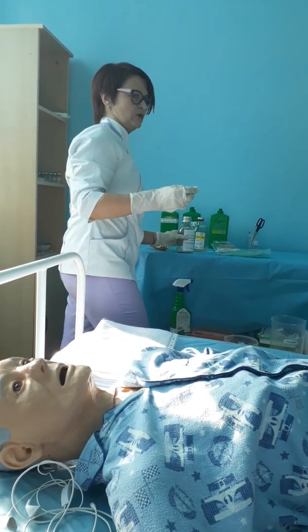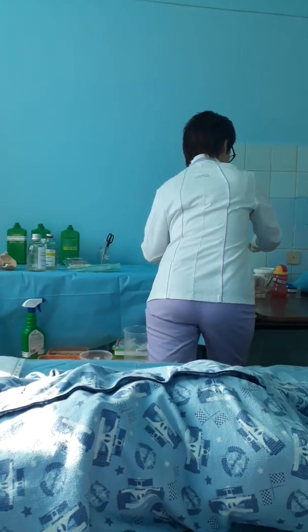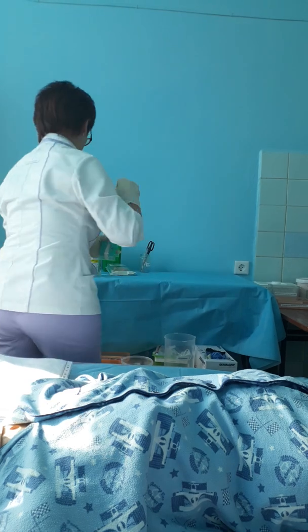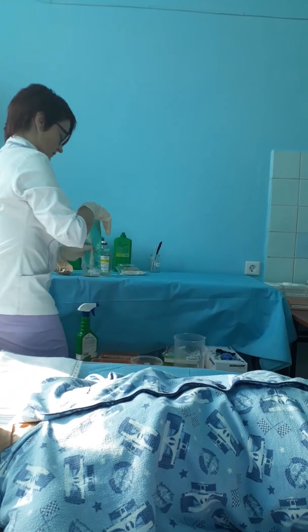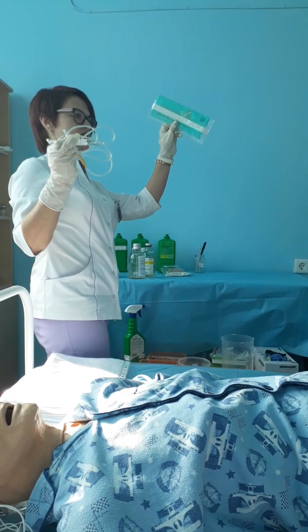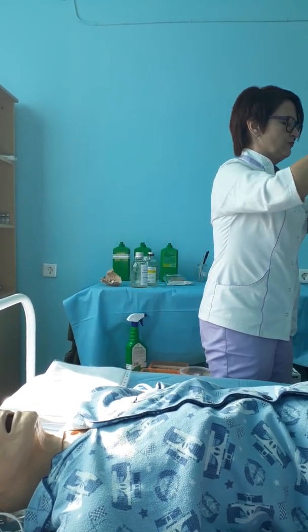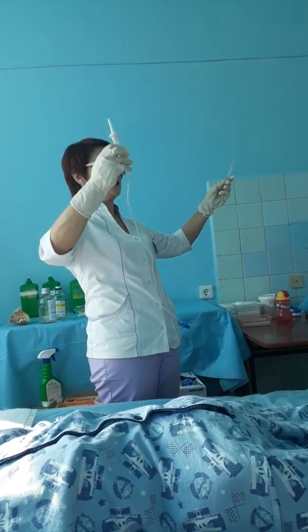And now you clean only the top. Yes. The solution must dry. During this time you take the AV. Open. Take the AV in your hand. It's used. This package in package. Yes. And now you must check your AV. You take your system in two hands and check.